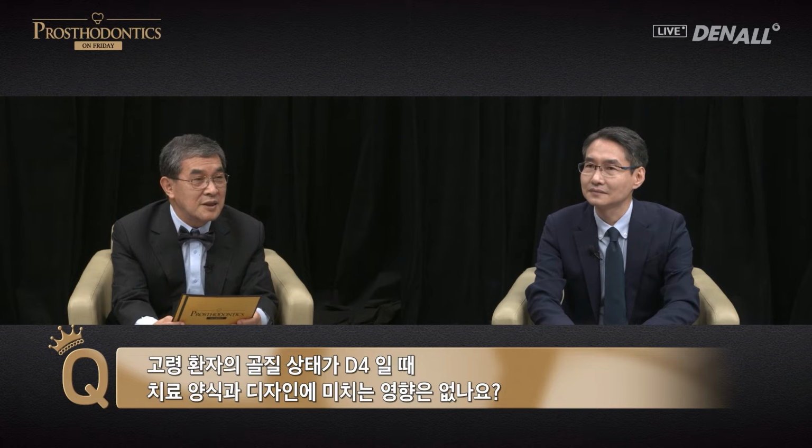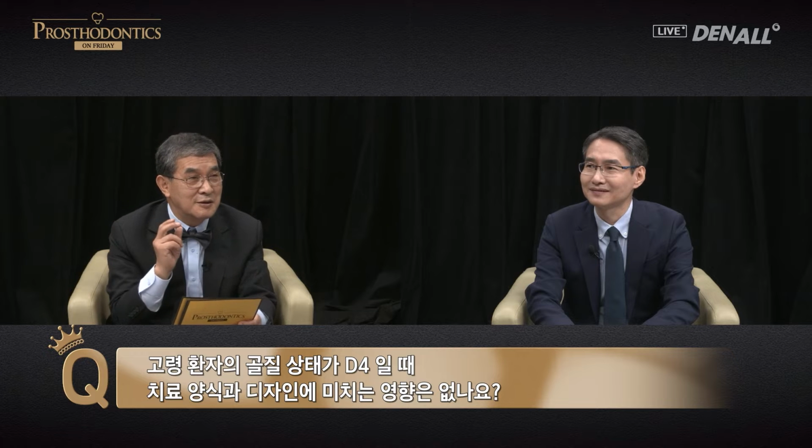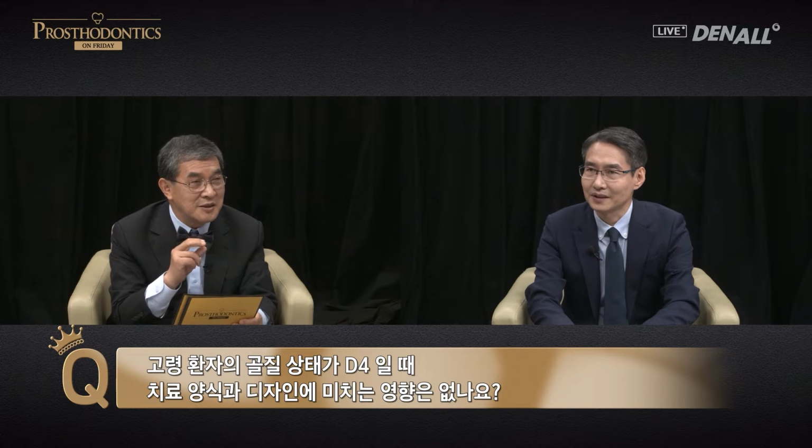However, when the bone quality is bad, we need to consider the antagonist. You need to consider whether the antagonist is sound or if it is partially edentulous. Please carry on with your lecture.